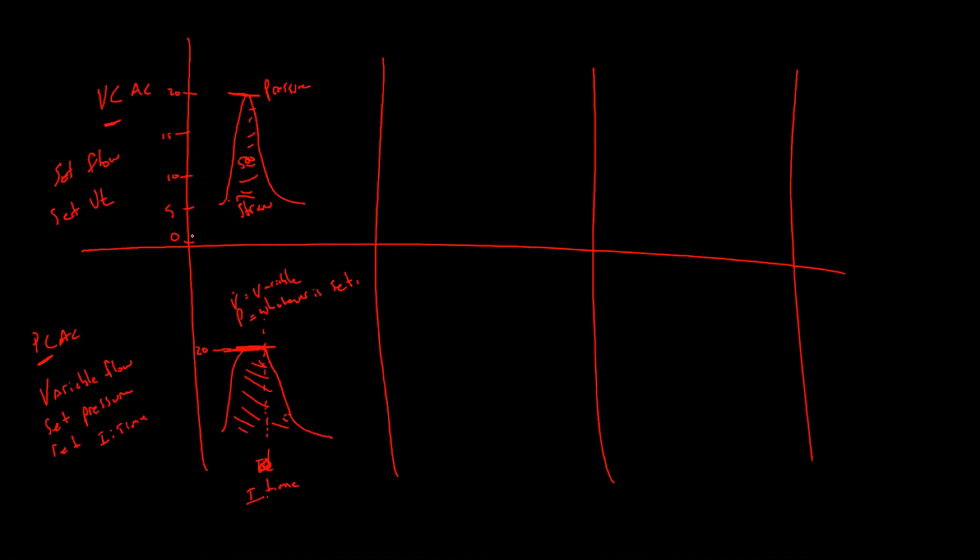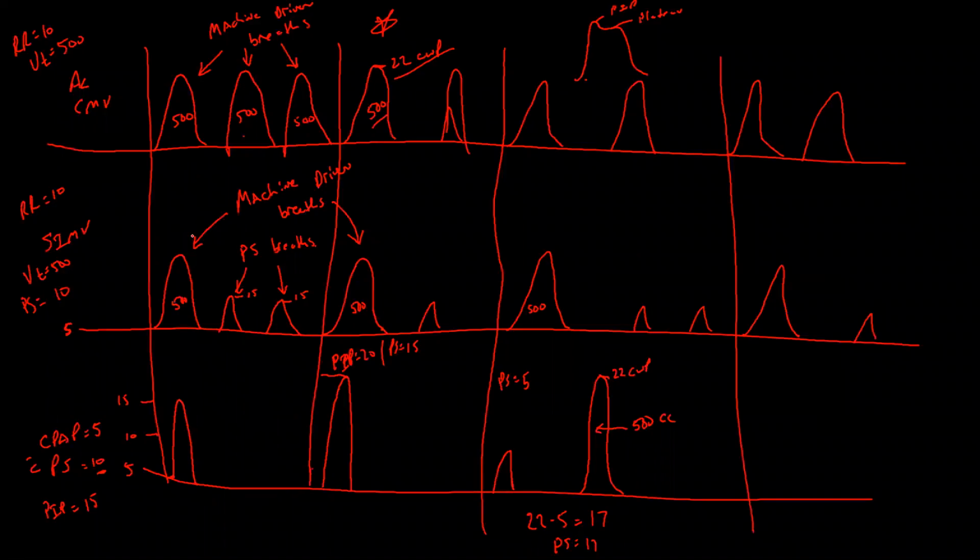Okay. Now I'm going to go back a screen. And guess what? These are volume breaths. These are pressure control breaths.